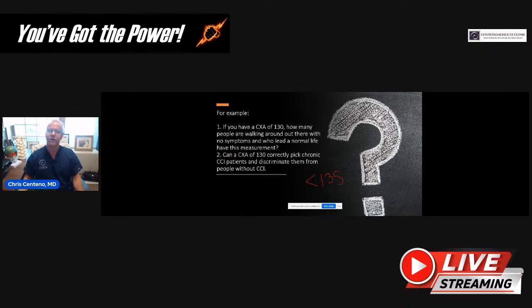So we're going to take someone who has a clivo-axial angle 5 degrees less than that, 130. But we're going to ask them important questions. We're going to ask how many people are walking around out there with no symptoms, leading a normal life, who have this measurement. And then we're going to ask another question: can a CXA of 130 correctly put people into the right bin?